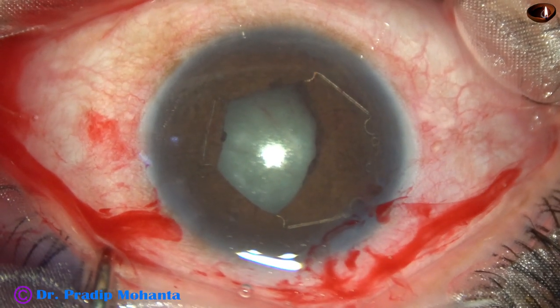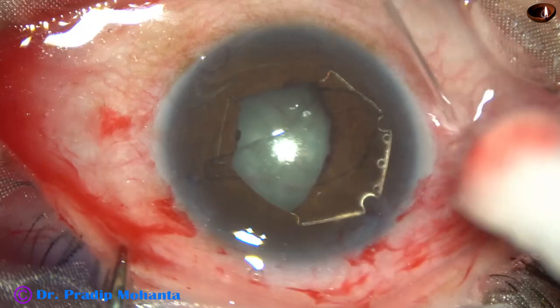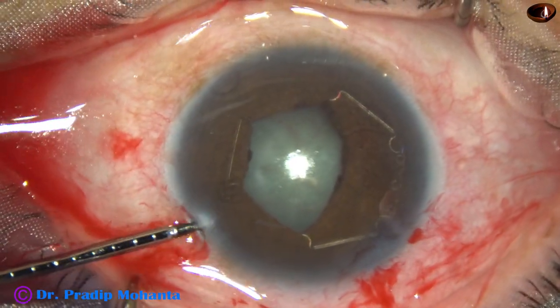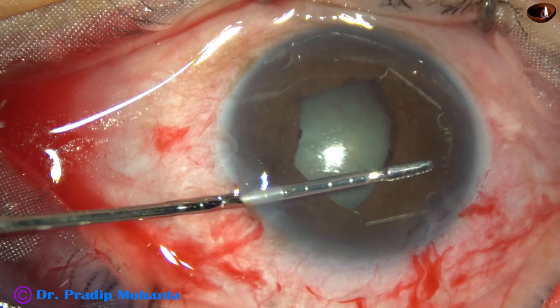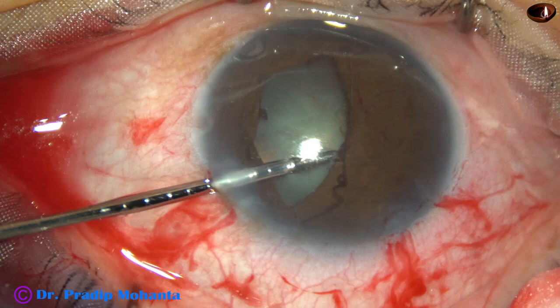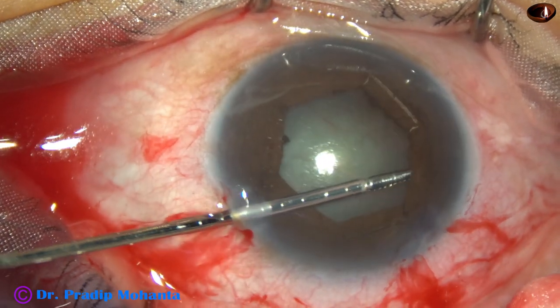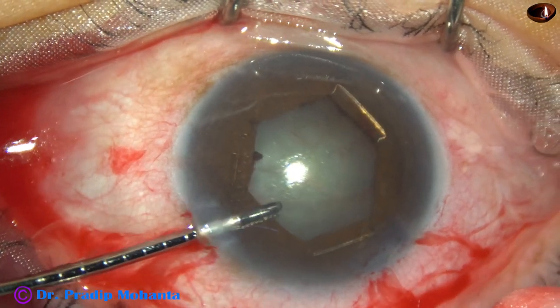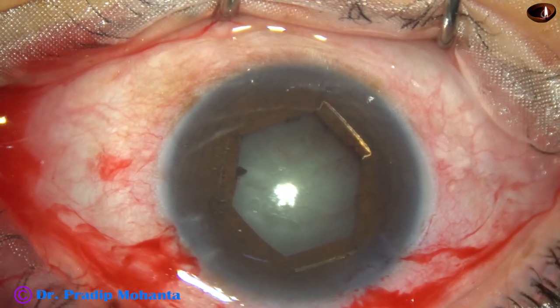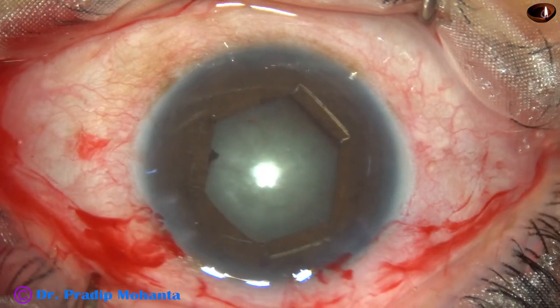Then tuck the flange which is at around one o'clock. Now I go through the side port — in this case there is only one side port — with the PHX forceps. Hold the middle tab of this flange and tuck it under the iris in this way, and we get a nice hexagonal-shaped pupil.